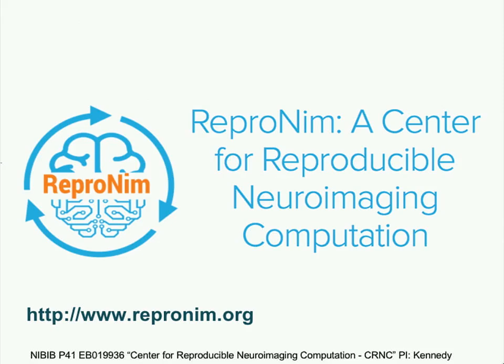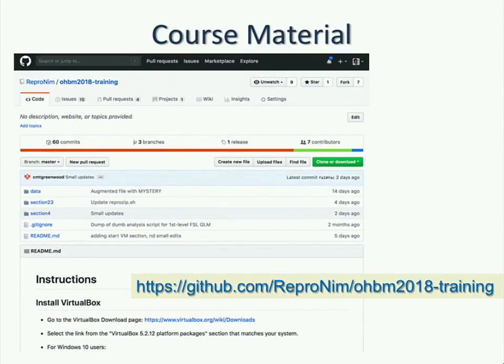As Dave mentioned, we are going to be doing some hands-on, and this is the morning, and so my section is actually fairly easy. There's not a lot of heavy lifting in terms of what people have to do in their exercises, but it is a little bit in terms of constructing some BIDS data sets and using some of the PyNIDM tools that I'll introduce people to. So it should be fairly straightforward, and we'll see if everyone's VirtualBox is working.